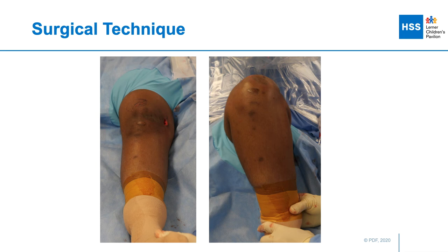Prior to final tightening, I cycle the knee from full extension to full flexion to make sure that there's no entrapped tissue underneath the plate that could block range of motion or capture the knee, and then I go down and final tighten the screws. The screws are sequentially tightened back and forth so that the plate comes down to rest on the medial distal femur.